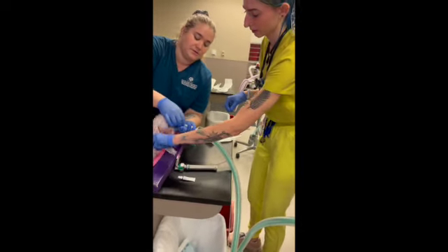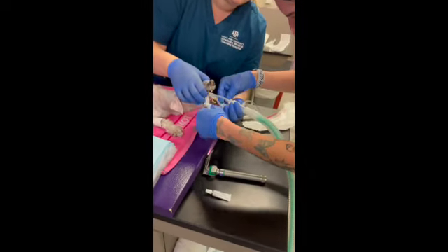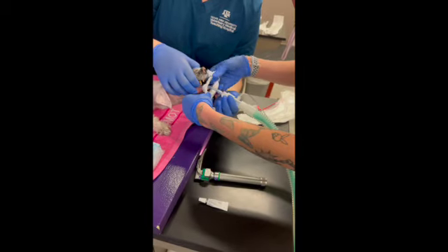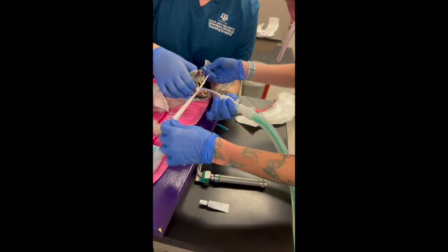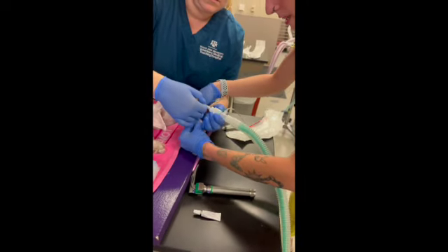And then I'll hold his tube here and keep his mouth open while you tie the tube. So now we're going to tie the tube. Will you let me know what side his tongue goes on? Great. And then for this procedure, we're going to tie it to the bottom jaw.